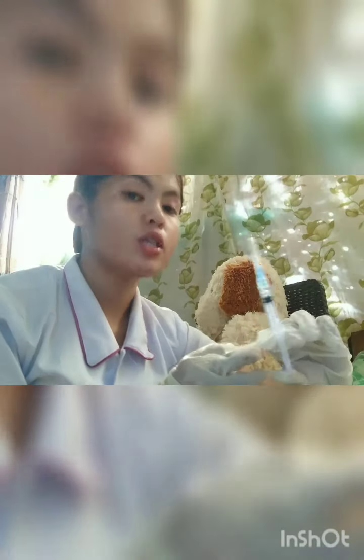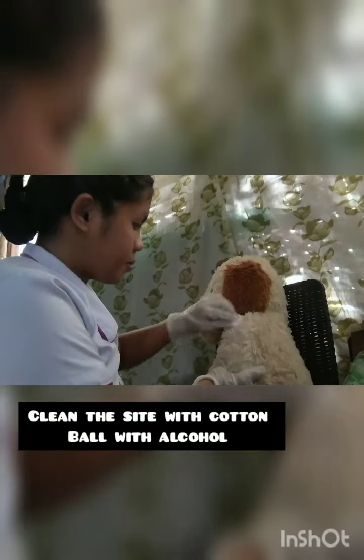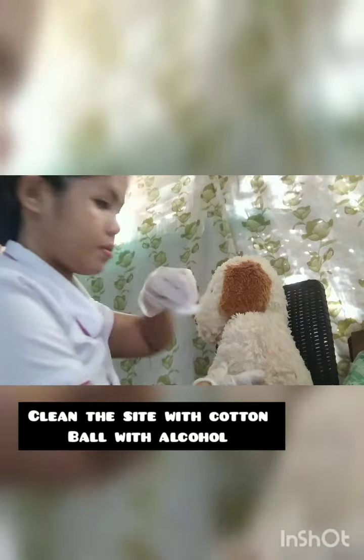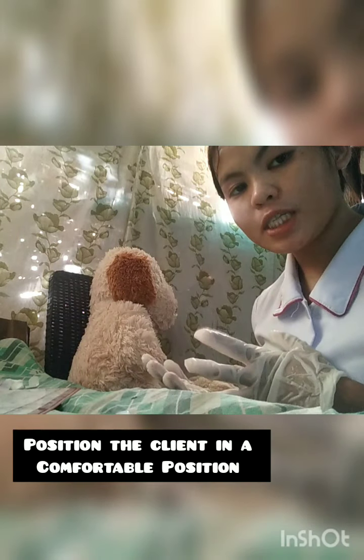Now I am going to administer 0.5 ml of tetanus toxoid to the right deltoid of the client. Clean the site with cotton ball with alcohol. Help the client in a comfortable position.